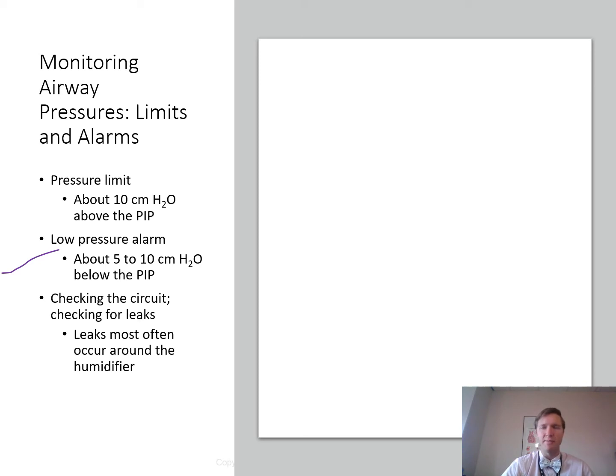The volume time waveform can also be checked if it resembles what looks like an igloo. And here's the picture here. Do you see how that looks like a little igloo? Right, you see the little igloos, right? So if it looks like an igloo, the inspired tidal volume is greater than the exhaled tidal volume. So that is a sign of a leak, right? And then go look at the graphics presentation. You'll see different things in there as well.